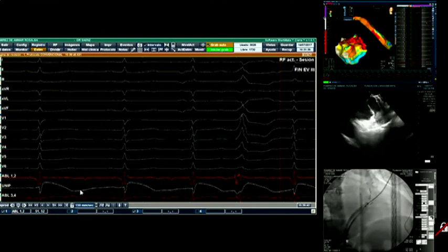But I agree with you, when you do something from the neck, you're limited to the diagnosis, and if you want to exchange for an ablation catheter, you're going to have to do it from the groin. And I think that is more radiation for the operator, but obviously you need to protect yourself also. But I agree with you. But we tend to do it through the groin rather than the neck. But I think that it could have been done from above also.